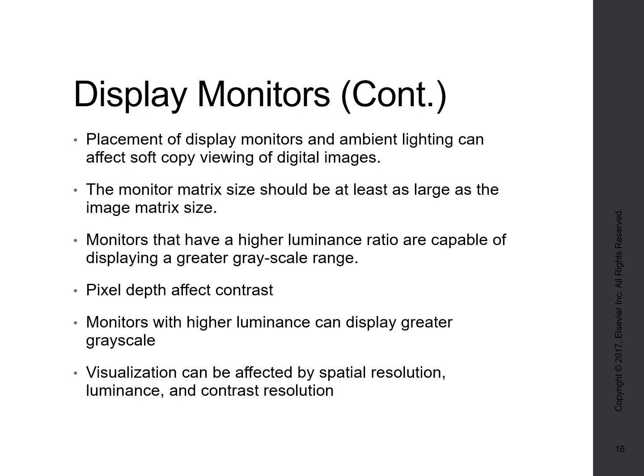Especially more so even for the radiologists, obviously. But the placement of the display monitors is going to be very well thought out. So it has to have an adequate amount of ambient light so that there's not any disruption of the ability to view the image.